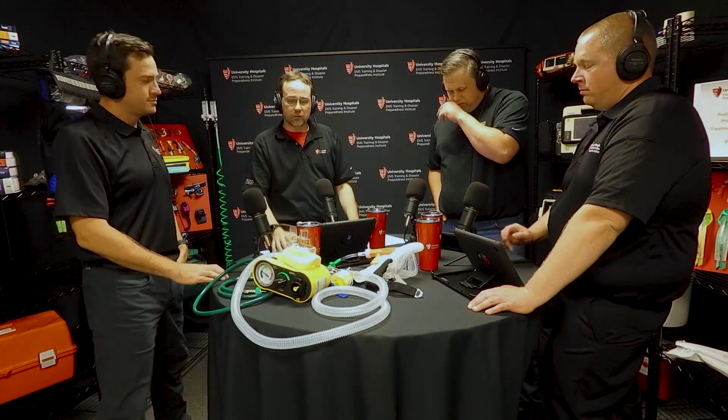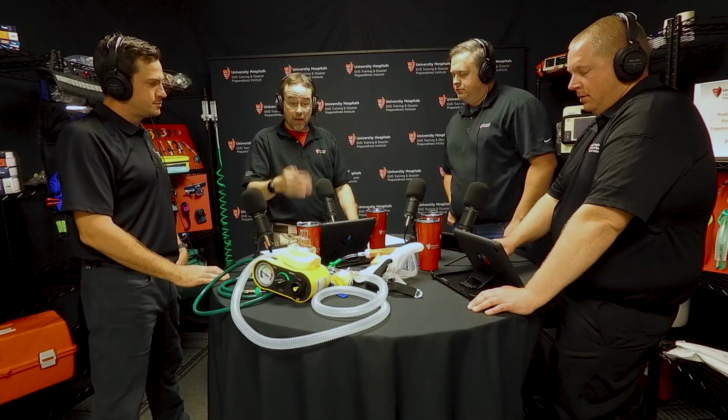We're talking about an abstract situation. In most situations, I think we should honor that and make the best of that time, because that's what we're here for. And I don't want any of the providers, and we've said this multiple times, down to the EMT, to be afraid of this thing. This is definitely a tool that's going to help you, and you have a very exquisitely low risk of harm. And for the paramedics that are starting IVs, you probably have a higher risk of causing harm with an IV than you do with this mask.